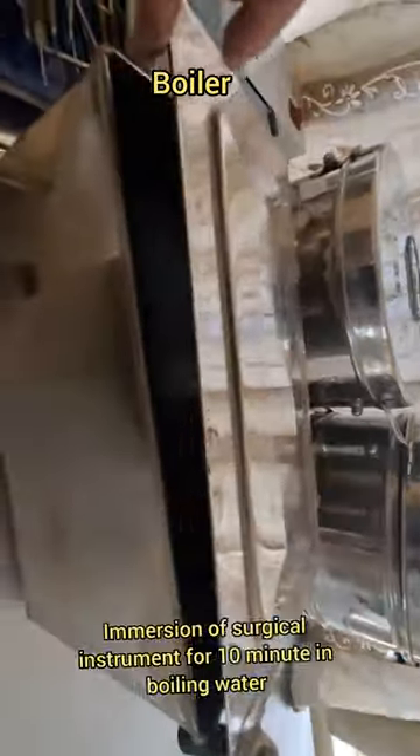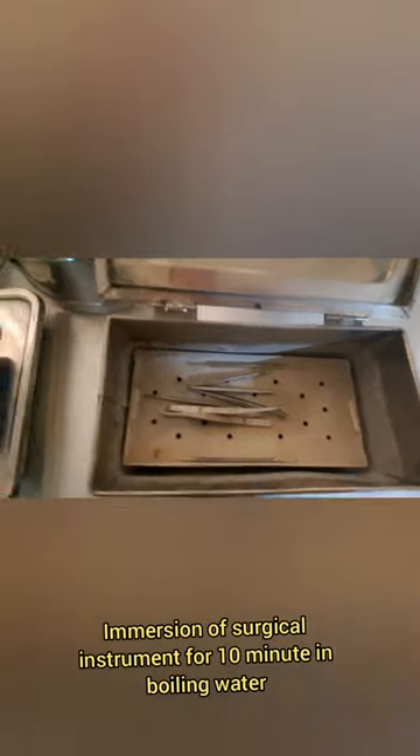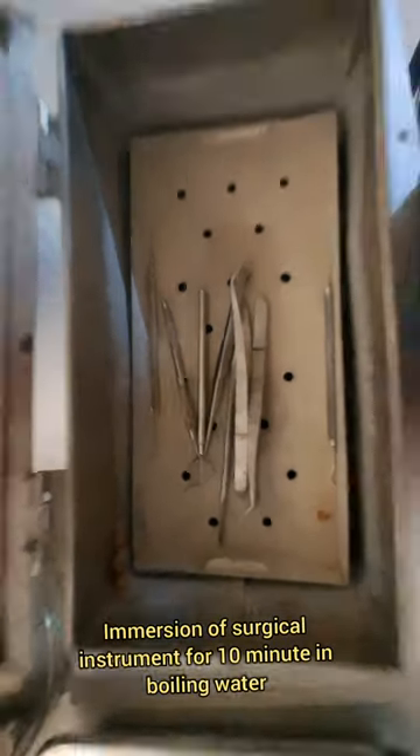This is Simple and Economical Methods of Surgical Sterilization. Immersion of surgical instruments in boiling water at 100 degrees Celsius for 10 minutes kills most pathogenic organisms.